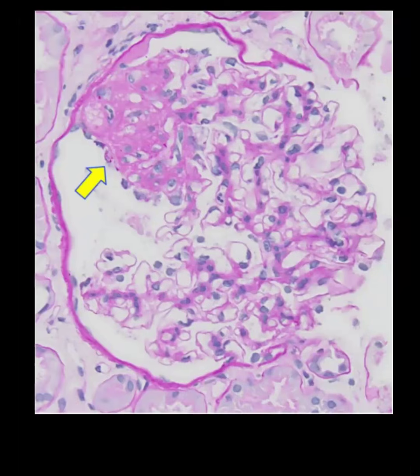But remember the mnemonic SSG. You know that Pakistan has the Special Services Group commando, SSG. So whenever the terminology is S for segmental, G for global, use a single glomerulus. SSG for single glomerulus, always terminology is segmental versus global. So here it is a segmental problem. Brother Muhammad is telling very right. So which disease is it? FSGS. Yes, it is FSGS, a segmental lesion.